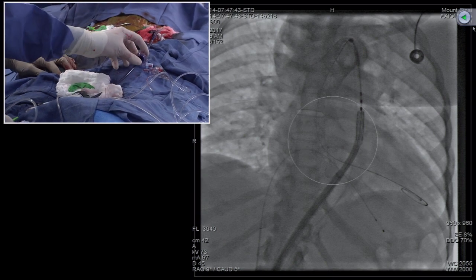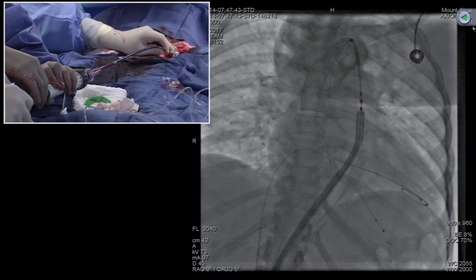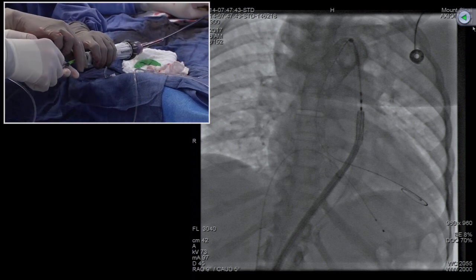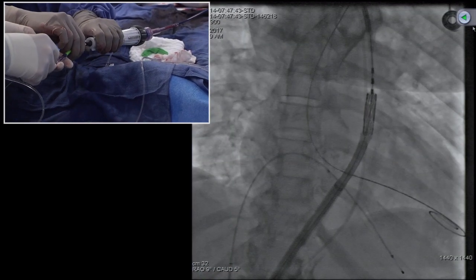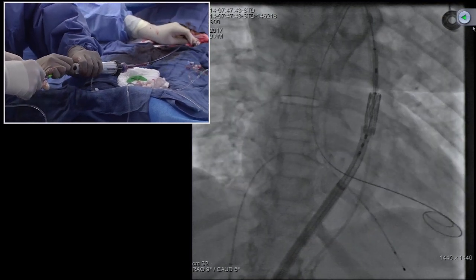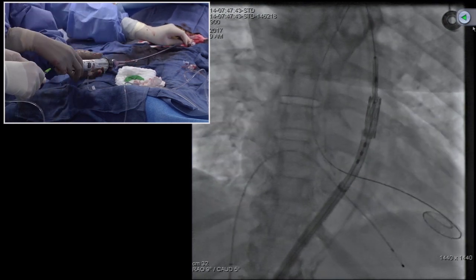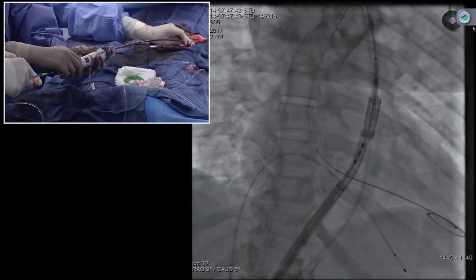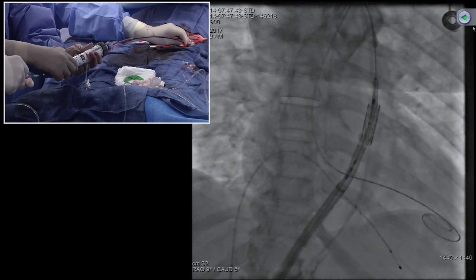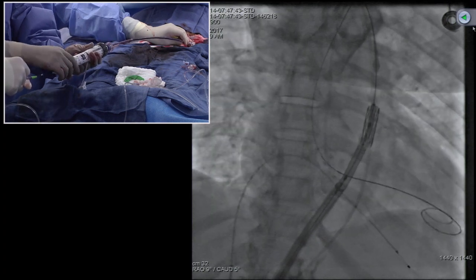So now what we are doing here would be the valve alignment. Essentially, what you're going to do is unlock, so the balloon will be free to move in the flex catheter. So what I'm going to do is just pull the balloon back. You see that? Balloon is coming back. Balloon should come inside the valve. This is where we are. We lock. So now the flex catheter will be moving. Take this fine adjustment. So the balloon keeps coming back. Right. The balloon is nice inside.